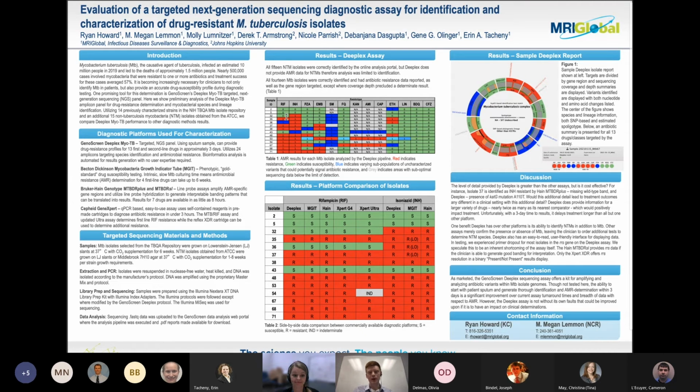So what we did is we took an assay that's gaining some traction in the tuberculosis community. It's an up-and-coming technology, and as part of the program, we advise clinicians, policymakers, and other stakeholders of best quality practices or assessments of new and upcoming technology like this.